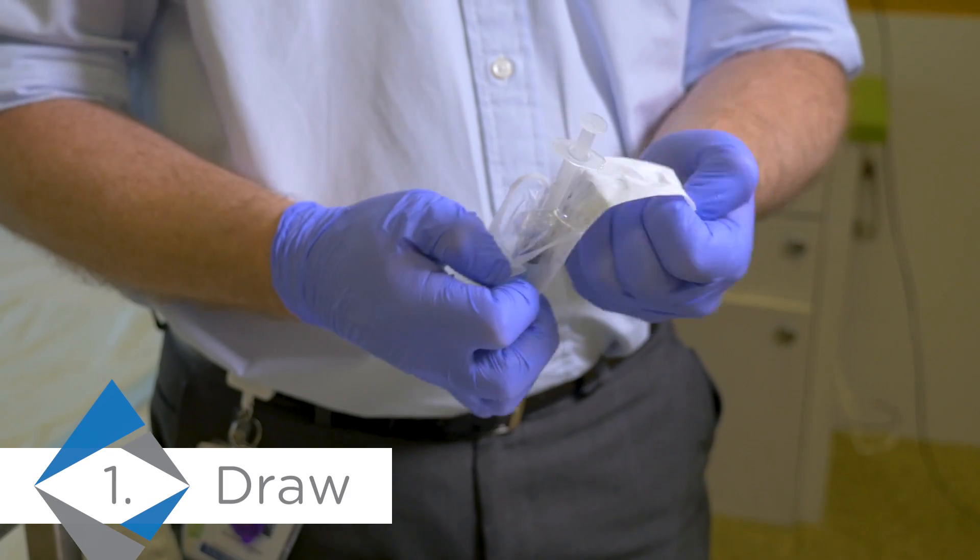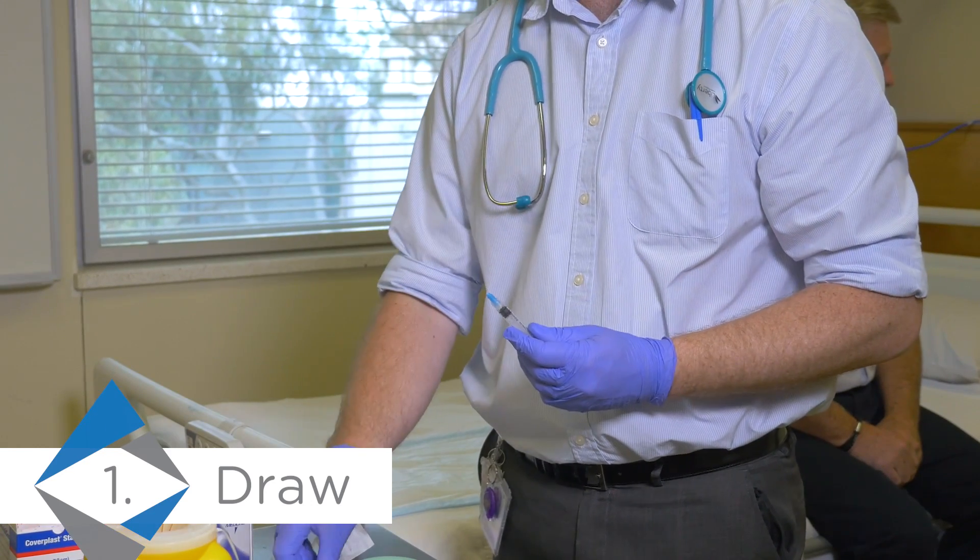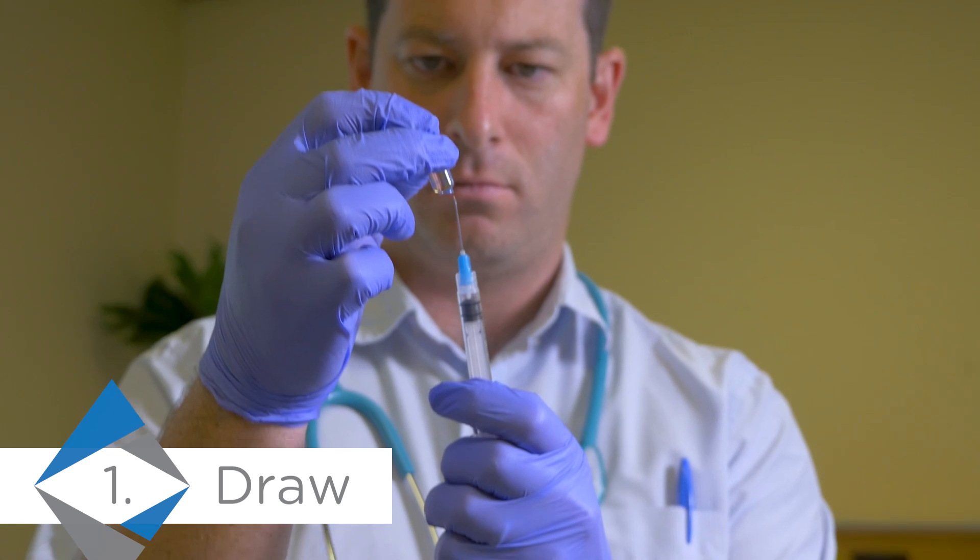First, make sure the needle is fixed tight. At this stage, do not fully compress the plunger to avoid activating the needle retraction mechanism.